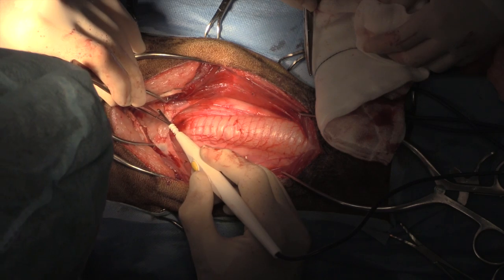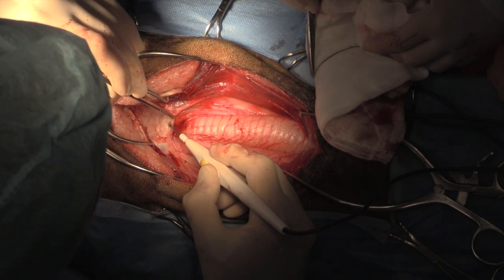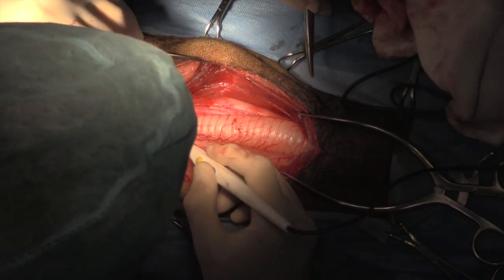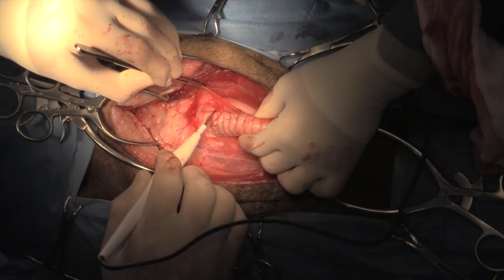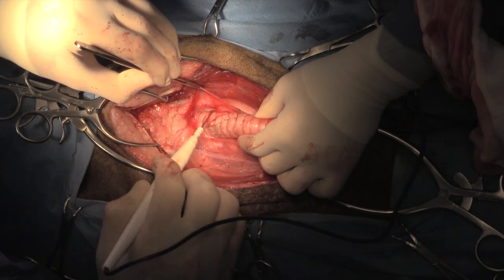The loose connective tissue around the trachea was very carefully dissected in order to avoid damage to the recurrent laryngeal nerves, which lie on either side of the trachea.